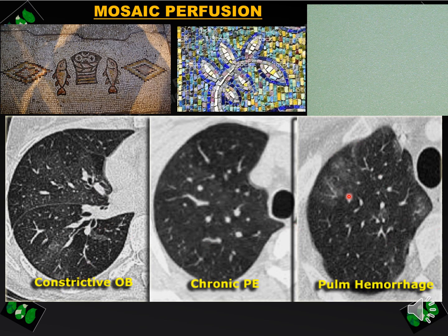However, when the high attenuation area shows high or equal blood vessel size compared with the low attenuation area, we consider the low attenuation area as normal. The high attenuation area then represents ground glass opacity — as in this patient with pulmonary hemorrhage — shown by these ground glass areas.